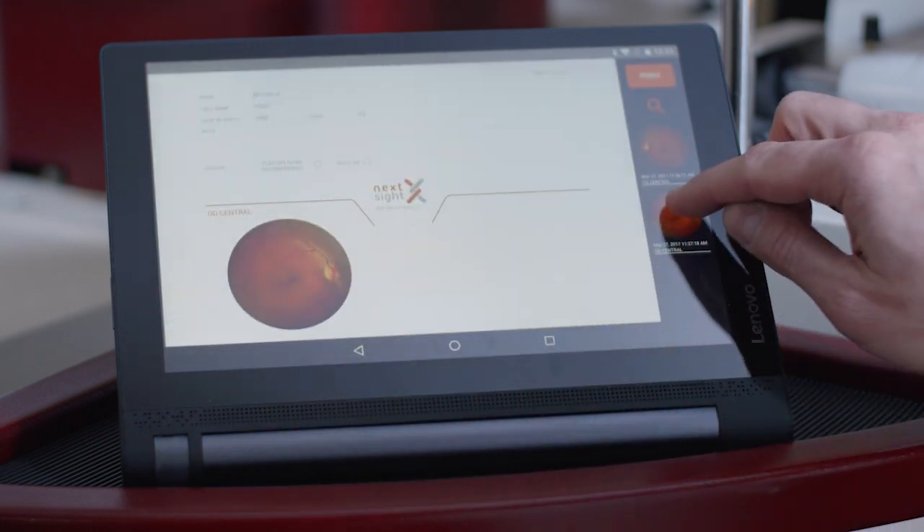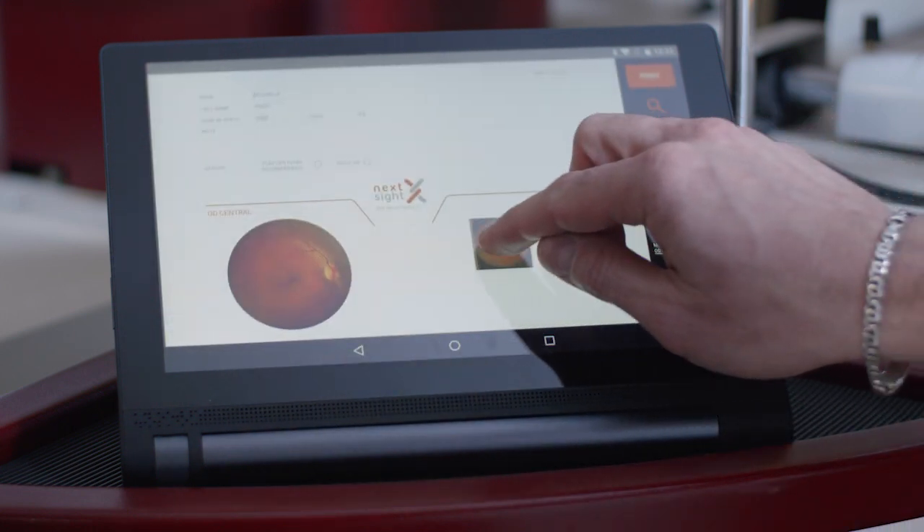Once the results of the examination have been acquired and evaluated, the report can be printed by the tablet and passed on to the patient.